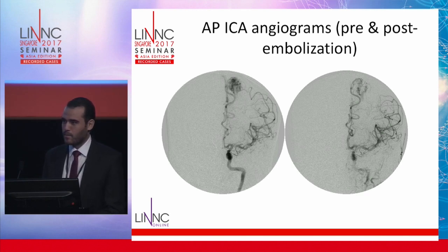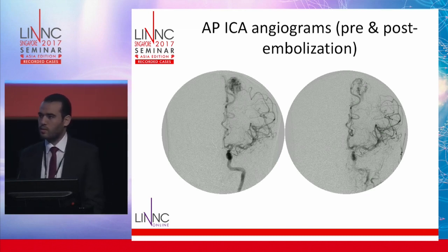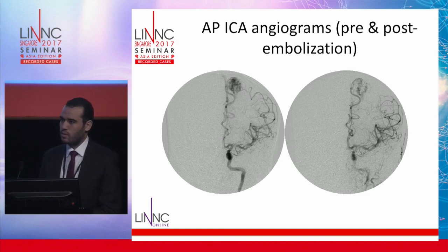Honestly, in this situation, you started the procedure as a pre-surgical process, right? Yes. Okay. And maybe in that case, it was a problem because it was not a big AVM, so you could have continued, occluded the vein, and gotten rid of everything at the same time. If you leave part of the nidus, you slow down the flow, and you don't give heparin to the patient later on, you might get thrombosis of the vein later on and then have this complication.